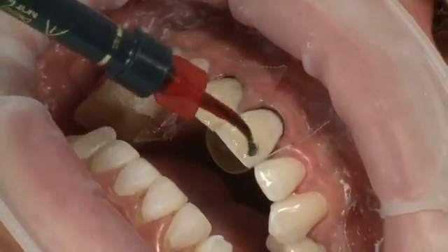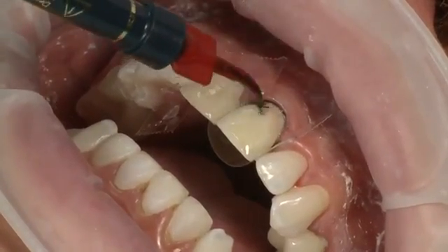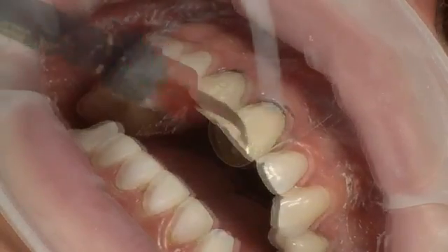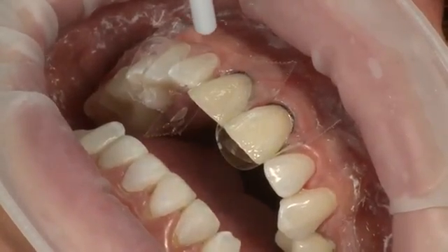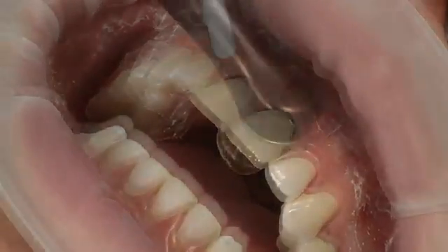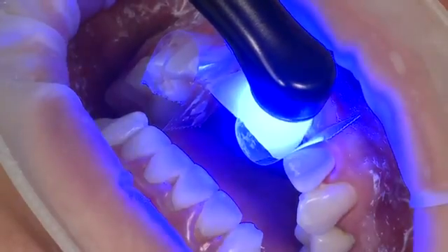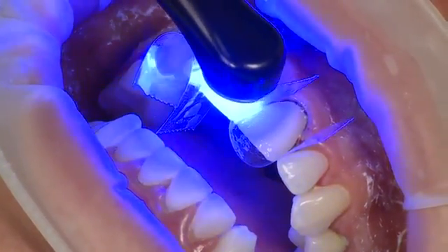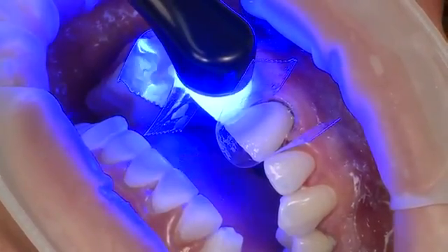Place Peak Universal Bond on the etched surface of the tooth to be bonded and gently agitate for 10 seconds. Blow air using half pressure to thin and remove solvents. Light cure with Velo for 10 seconds on standard power mode, or 20 seconds if using a curing light with an output less than 600 milliwatts per centimeter squared.